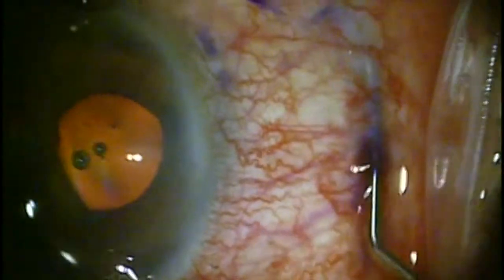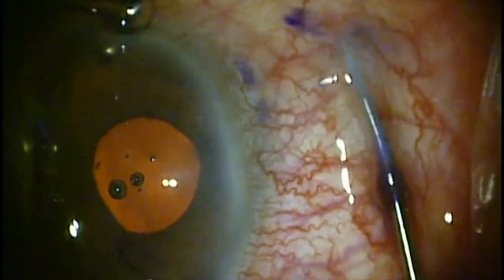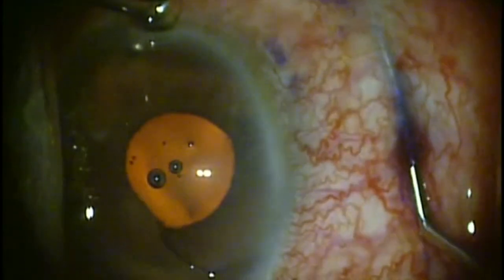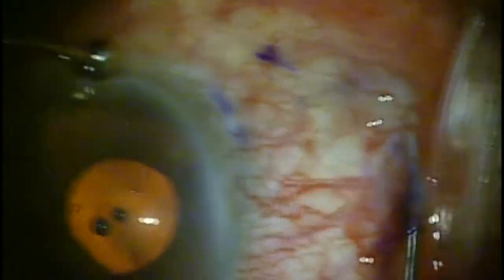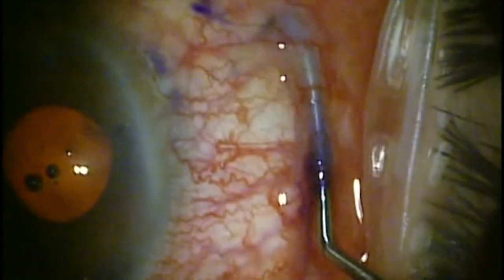The dimensions of the XEN Gel are 6 millimeters in total length. According to the manufacturer, ideal placement is 2 millimeters in the subconjunctival space, 3 millimeters in the sclera, and 1 millimeter into the anterior chamber.